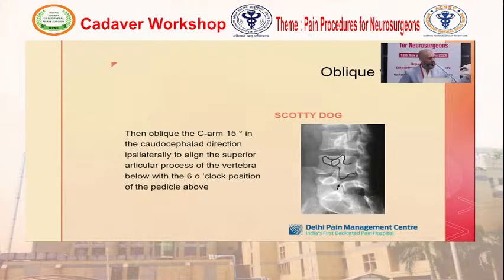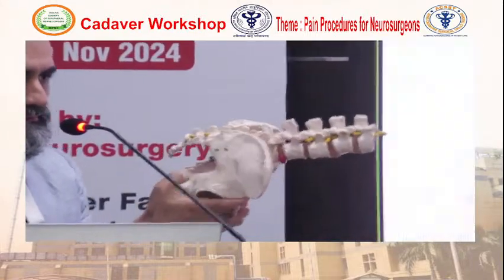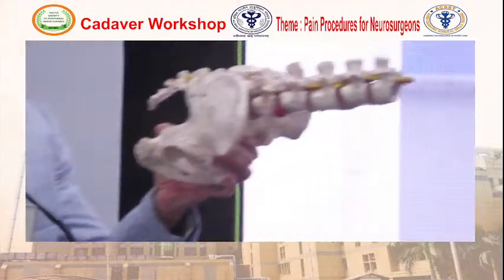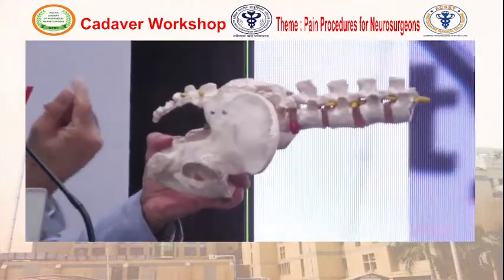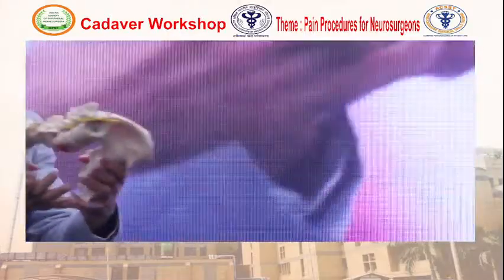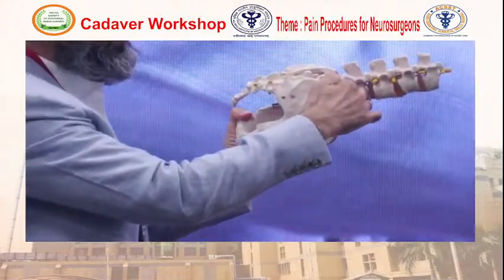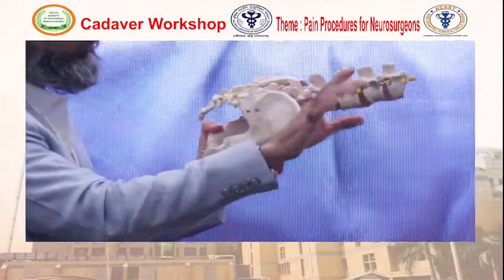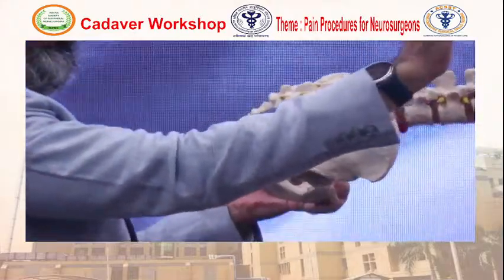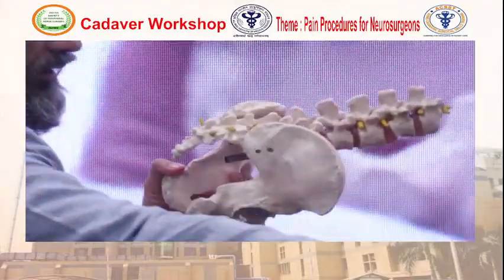Okay, so right now we had the patient who was being placed like this. This is AP. Can I get a volunteer? I'll make it more interesting. Can somebody just come? So this is how the patient is, right? You have to see here. So this is exactly the position of the spine. We have made it oblique. We have made it cephalad or caudad. So the ideal thing would be like this.